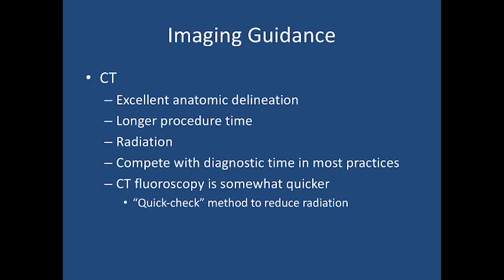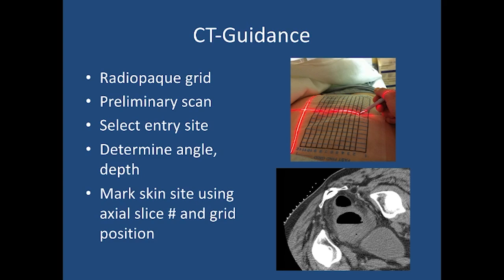And this sort of CT fluoroscopy quick check method may enable reduction in radiation to both the patient and the operator when CT fluoroscopy is considered.